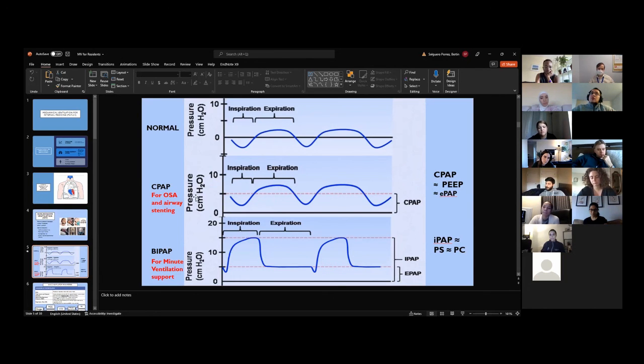Thank you. And that's why I gave you the example of these COVID patients that have severe respiratory alkalosis because they're breathing so fast. But they're hypoxic, so we place them on BiPAP. So the moment you do give them BiPAP, the tidal volumes go up to 1,500. And that patient starts getting severe respiratory alkalosis. And for anyone that has had alkalosis ever in your life, it feels horrible. You start having a lot of headaches, and it makes you feel like you're passing out. So to avoid that, CPAP is more effective because it provides no tidal volume support.